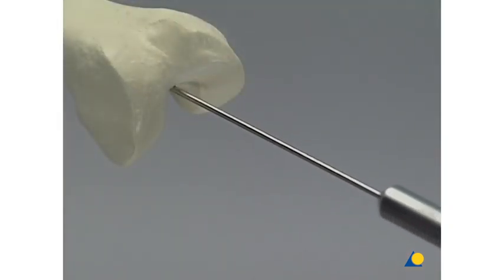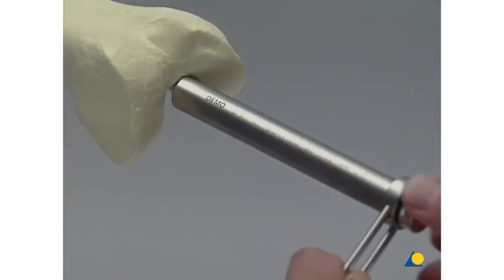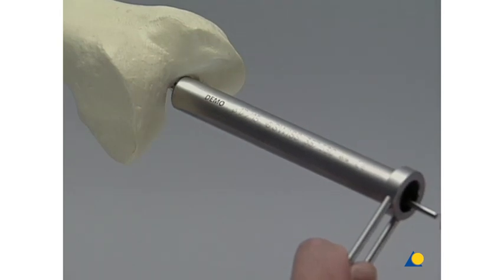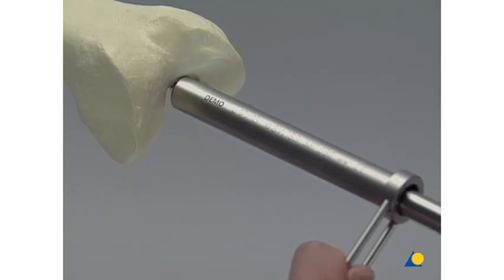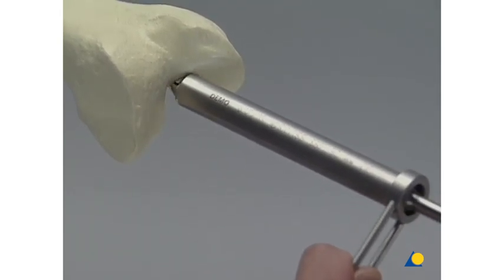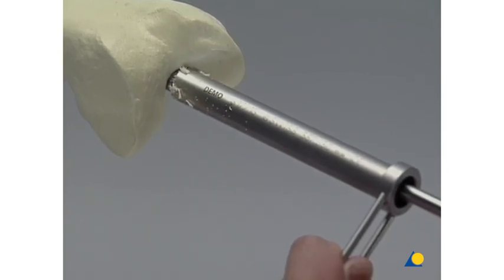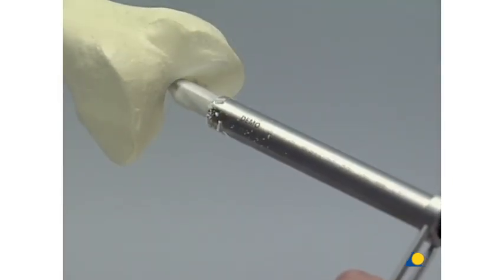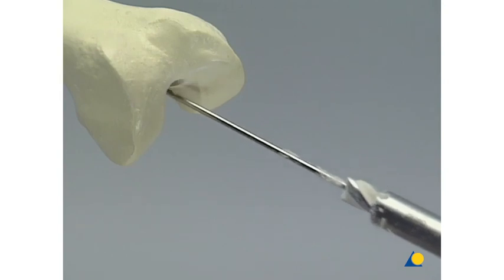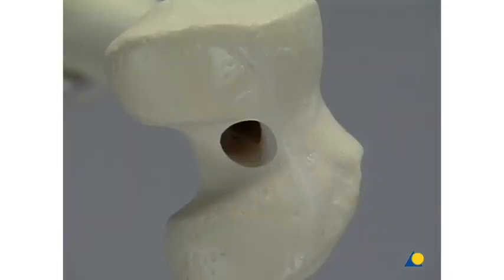To open the medullary canal, the protection sleeve and drill sleeve are pushed over the guide wire onto the notch, and with the drill bit, the medullary canal is opened to a depth of approximately 30 mm. The drill bit, protection sleeve, and guide wire are then removed. The knee joint is carefully rinsed to remove all drilling debris.